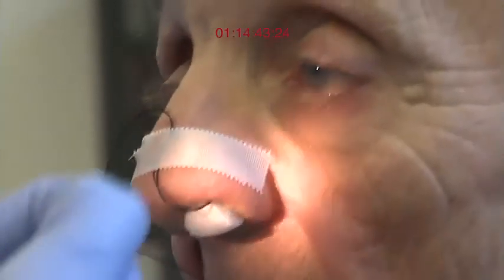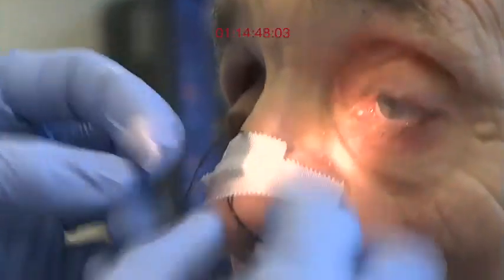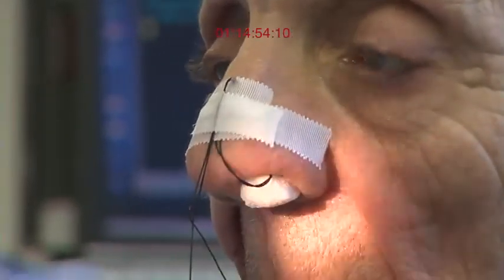The tie must not press against the alar margin, as it may cause alar necrosis, resulting in an unpleasant deformity. If both sides have been packed, the ties can be tied together. The pack should stay in for about 24 hours. Before removal of the pack, it should be rehydrated using the same technique as described earlier. If the patient is very anxious, but otherwise healthy, a small dose of diazepam can be given. Elderly patients with bilateral packs need careful observation as they may become hypoxic.